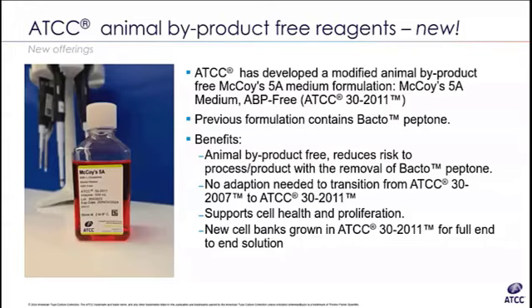Yeah, so with the kit, it's more of an identification of contamination being present. You'll get a band if there is one of the 60 species that are detectable, amplifiable by the primers. So it'll tell you if you do have the contamination or you don't. It won't tell you which species, and it is very specific to mycoplasma. So you won't get bands if you have other bacteria or microbes in your sample. It's very specifically mycoplasma.